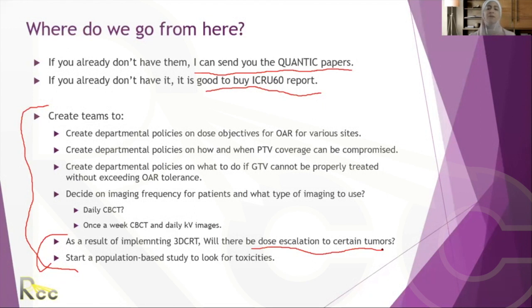I put that with a grain of salt, just to give us an insight. Some SIB could be possible in 3D CRT, could be possible. But once you build experience, I would say at least 1 to 2 years, you might think to improve on your practice.